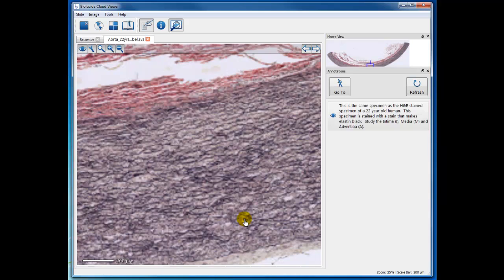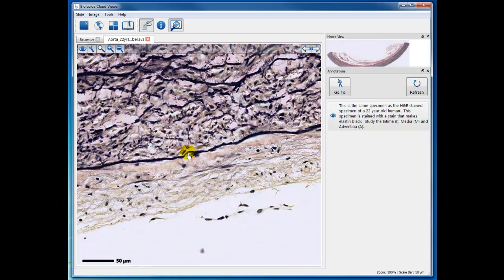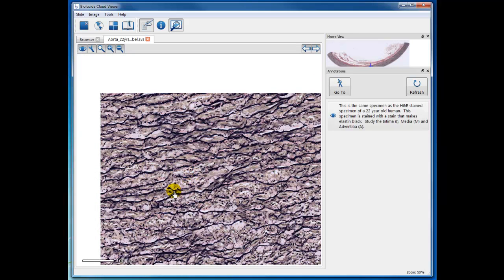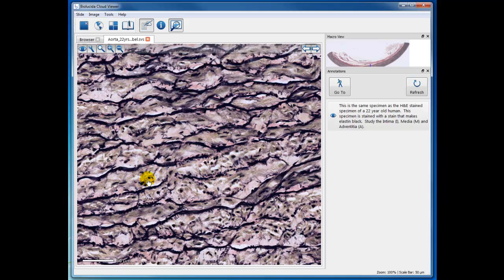This first elastic membrane down here is fairly complete, but the rest of them show a lot of, I'm not sure the correct term is wear and tear, but there are all these cells in here, a lot of them smooth muscle cells that are connected between one membrane and the other and provide a tension threshold for stretch.